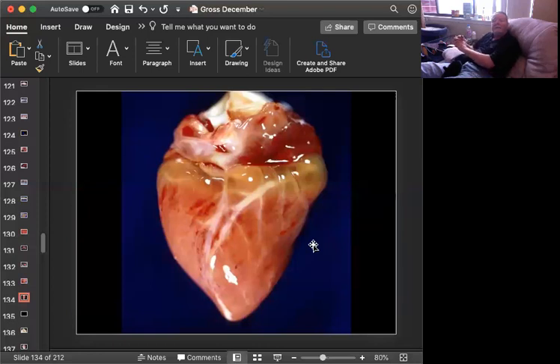Okay, finally, this is tissue from a goat. Can you give me a morphologic diagnosis? Okay, time's up. If you post old goats, not old goats like me, but actual goats, if you work out in an agricultural area, chances are you get a couple of goats a week. And a lot of times these goats will be old. They may have been on a bad plan of nutrition because people seem to think, A, that goats can eat anything, including paper and old tires or whatever. They put them out on the worst type of forage.